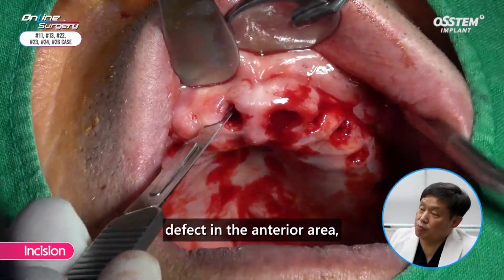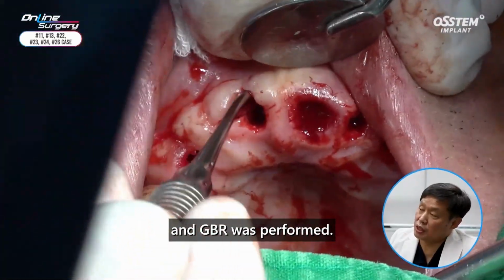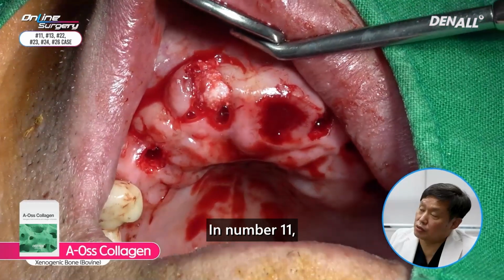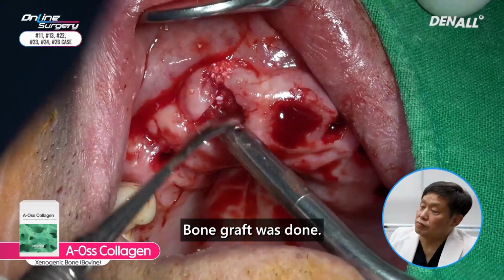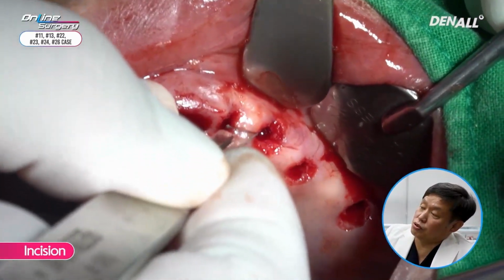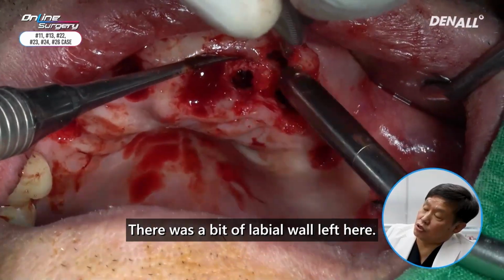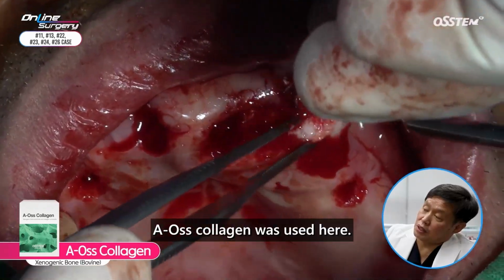Because there was a bit of defect in the anterior area, minor incision was made and a GBR was performed. In number 11, and the labial defect, A-OssCollagen was used. Bone graft was done. In number 23 and 22, minor incision was given and bone graft was performed. There was a bit of labial wall left here. A-OssCollagen was used here.